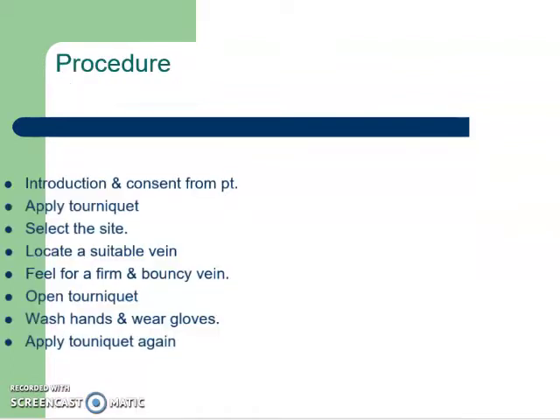Now, coming to the procedure, how do you cannulate? First and foremost, when you go to the patient bedside, you have to introduce yourself and tell the patient what you want to do and take the patient's consent. Here, the consent is not written, it is just a verbal consent.